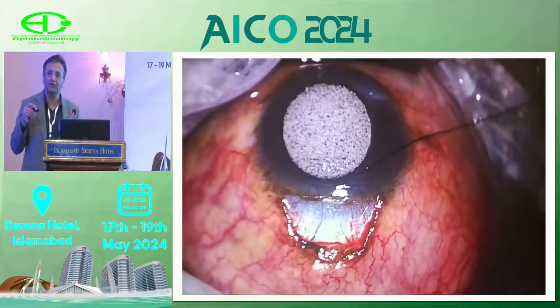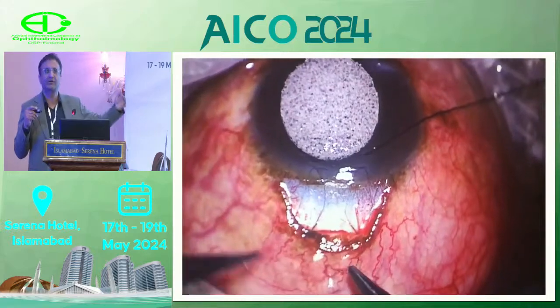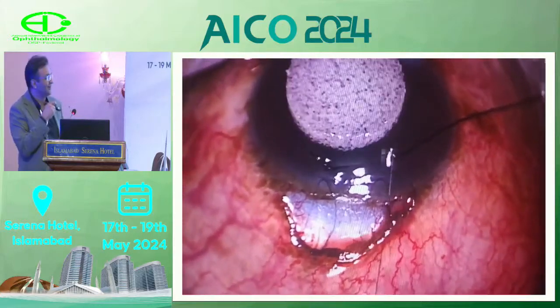मकसद ये है कि आपने टीनॉन को वापस ला के उसकी एनाटोमिकल पोजिशन पर सूचर करना है. Do not allow the tenon to fall back. Do not cut the tenon. तो अब ये देखें, इमरान मसूद कर रहा है जो हम सब का मेंटोर है.